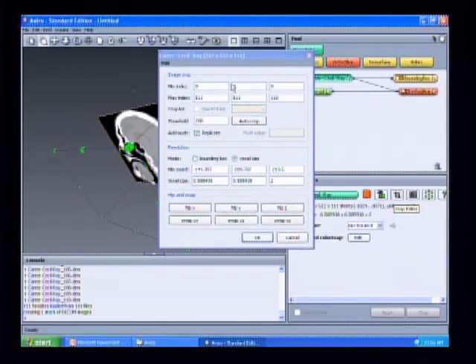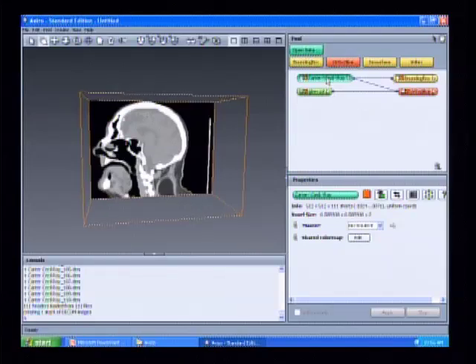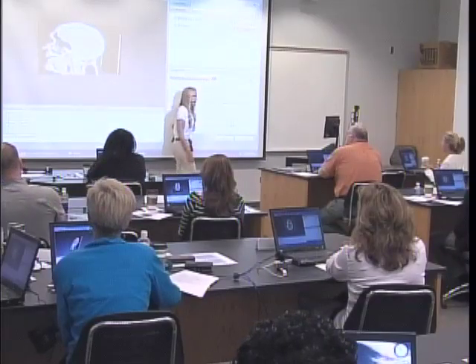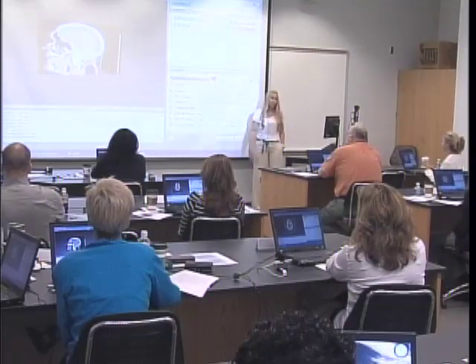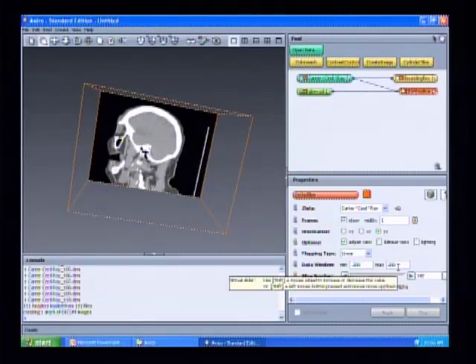So we've already gone through this, and if I just cancel this out, you can see we've been a little generous in our main boundaries of this Ortho Slice. We could obviously go through and remove some of this posterior side of the scan. We actually didn't leave much room at the top, so we're pretty good on that boundary. But depending on your preference, you could go through and crop out a little more. For what we're doing today, I think we're pretty good right here.